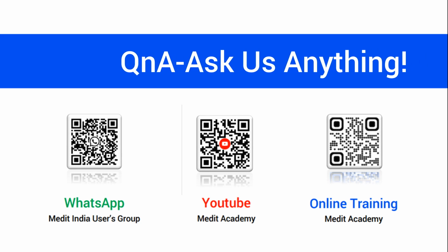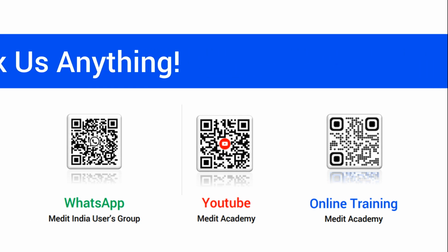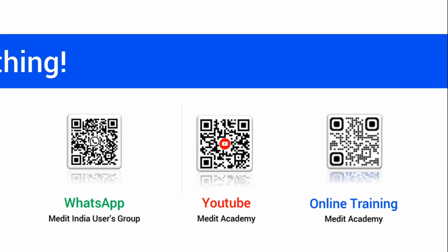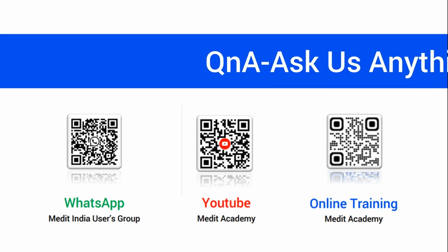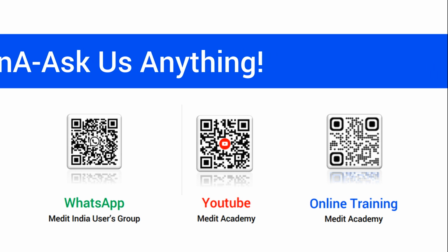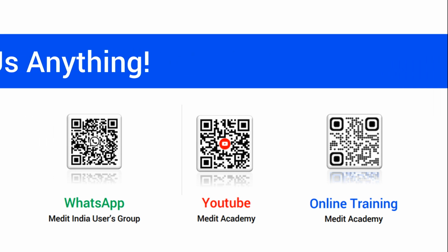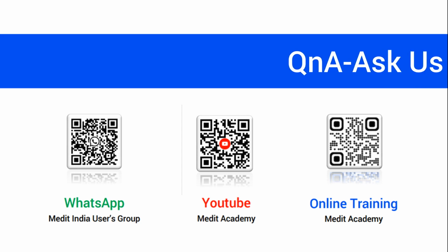And third, and one of the most important, I would say, is Medit Academy. Medit Academy is a beautiful platform for you to learn everything there is to know about Medit software, from how to make a case to how to create unique designs. Everything is there on the academy. It's a completely free, self-paced course, and by the end of it, all of your questions are going to be answered.